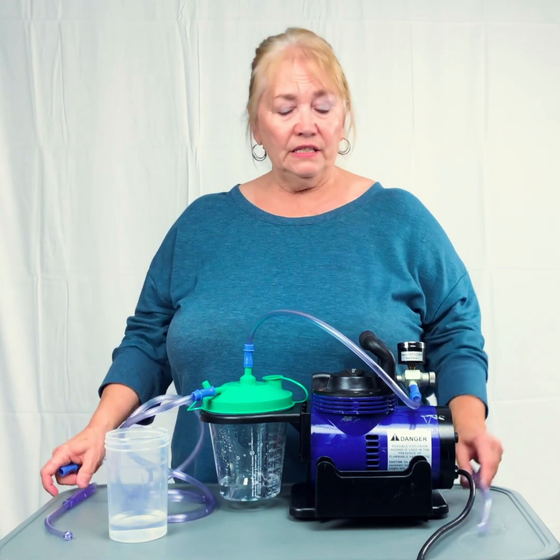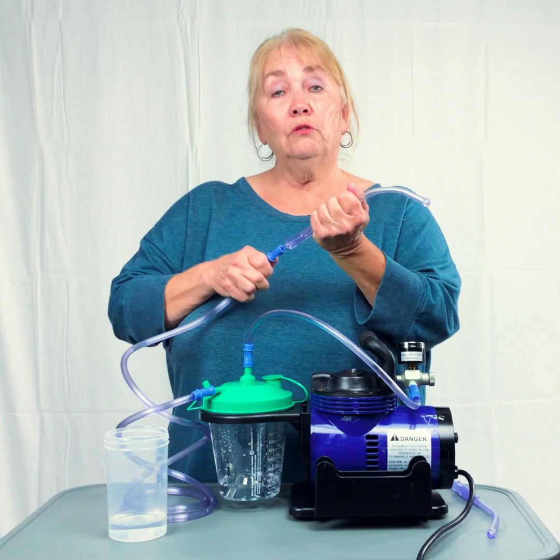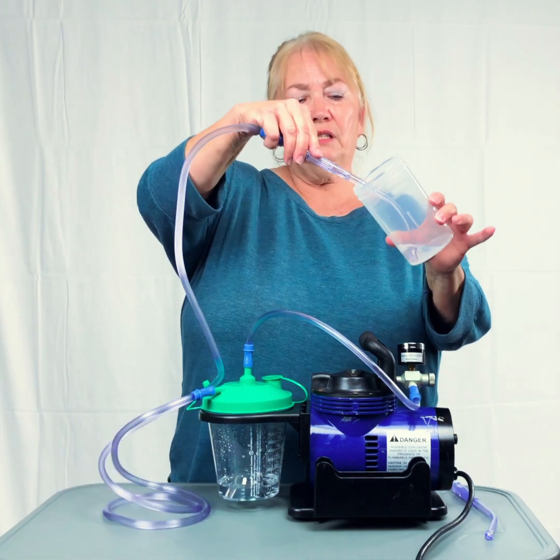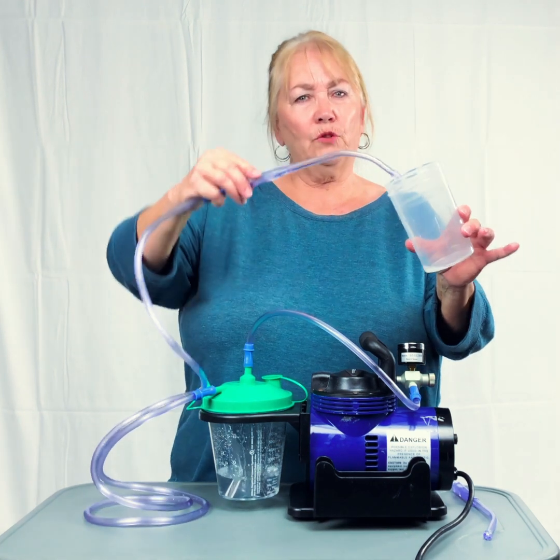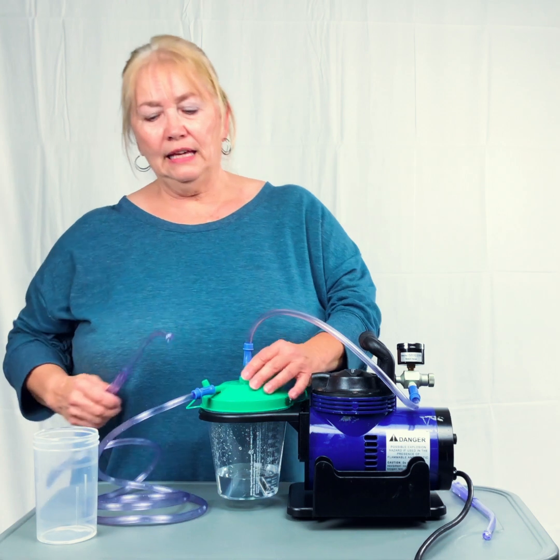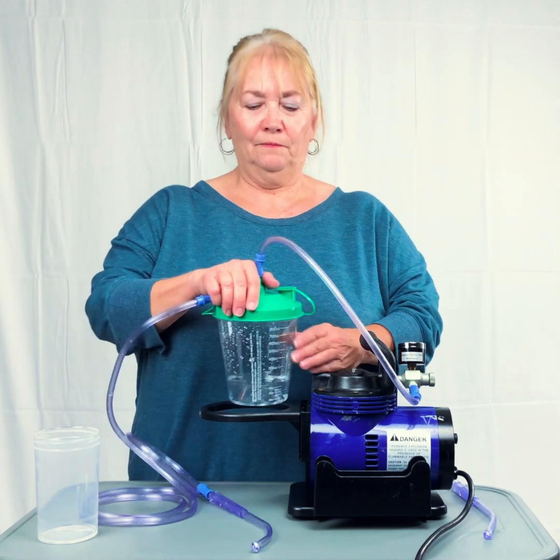Now with the non-vented, you don't have to worry about covering that hole. As soon as it gets to the secretions, it's creating the vacuum. And therefore, everything is being removed.